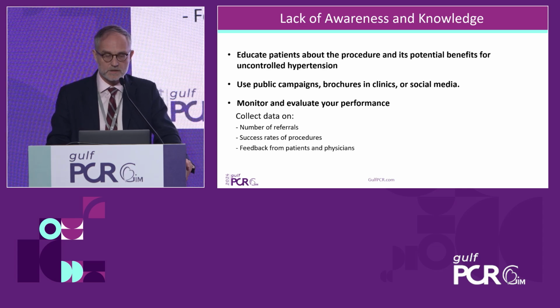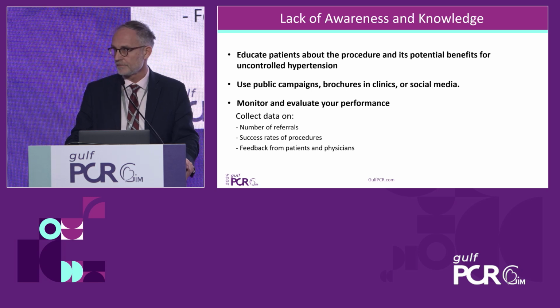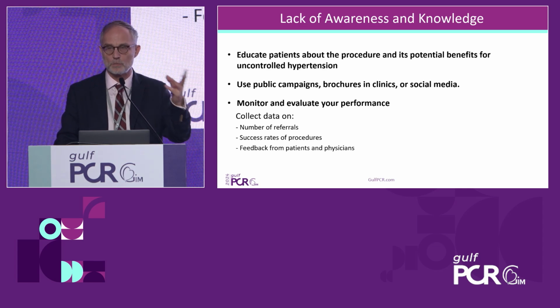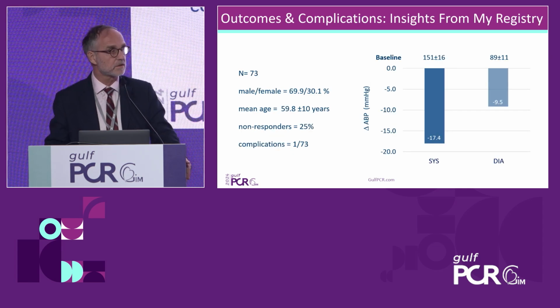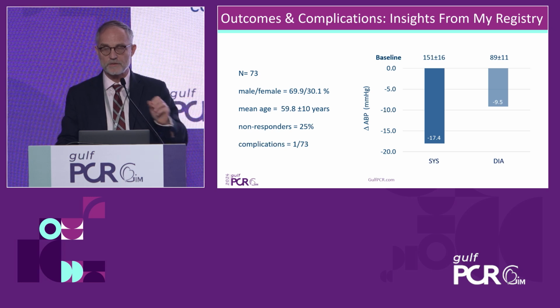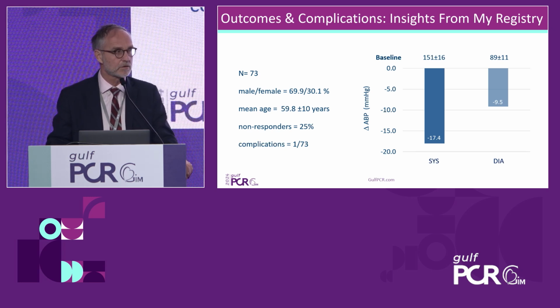And I think it's important to monitor and evaluate your own performance. You can collect data on your number of referrals, success rates of the procedure, and so on. And I'll show you what we have done in the commercial cases in the last 3 years. And you see it here. This was 73 patients. You see there were about 70% male, mean age around 60 years, and 25% non-responders. Wherever you go, you have 25% non-responders.